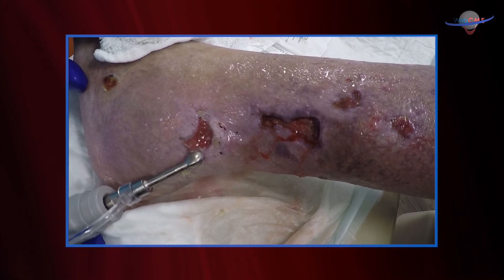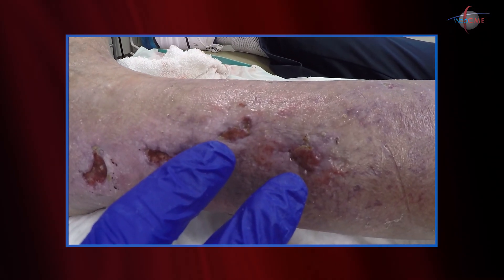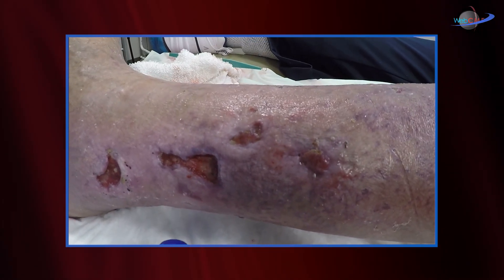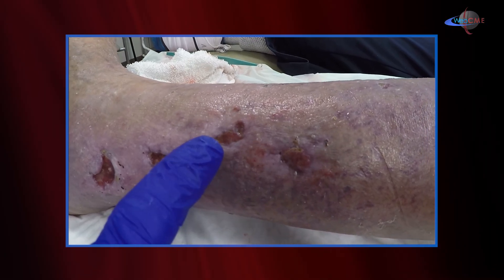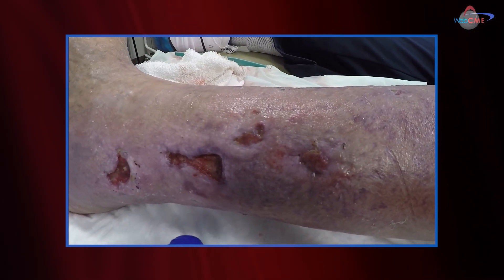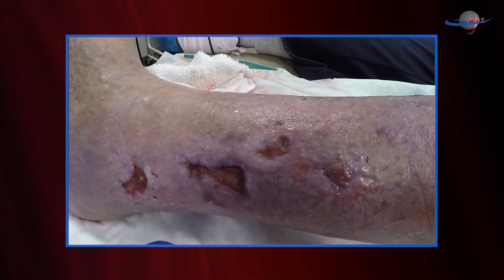What we're illustrating is that these two wounds here were grafted last week with the Caceres Omega 3 wound matrix. Over a one-week period we got great eschar formation, which was removed. Underlying that, we have wounds that have healed with neoepithelium. This neodermis is very immature and we're just going to allow that to continue to mature. Certainly a case could be made for not having taken those eschars off, but I wanted to see what happened over the course of a week — and we got some great results.